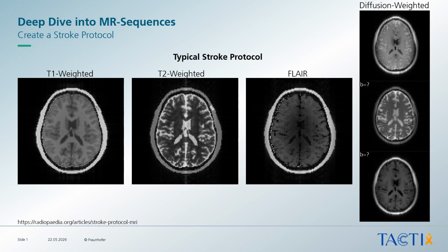All right, so we are back from our gammaStar front-end experiment. So what did we see? The T1 weighted image can be created using a FLASH sequence with short echo times and short repetition times. T2 weighted image is best created using the RARE sequence with long echo times and long repetition times.